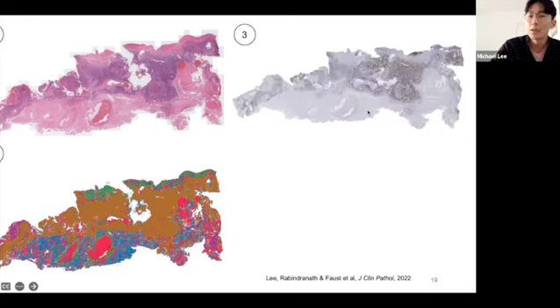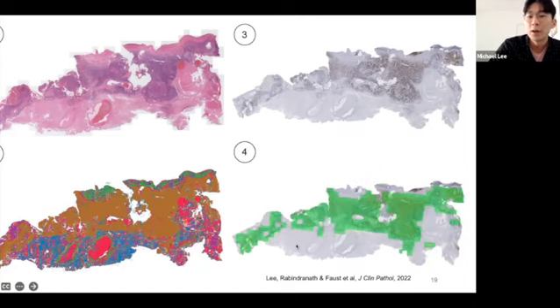And so when we look at this Ki67 IHC marker, we can see that it approximately stains positive, specifically in the tumor region of this tissue. And so when we use SIFT, we can focus our analysis specifically on the tumor region by getting the coordinates from the original H&E stained whole slide image based on the heat map, specifically analyzing the tumor region for the IHC to get this focused analysis over here, as you can see in the fourth step in this green region.